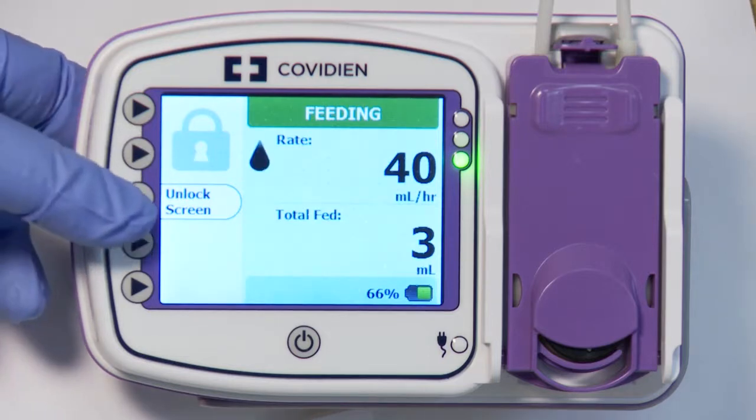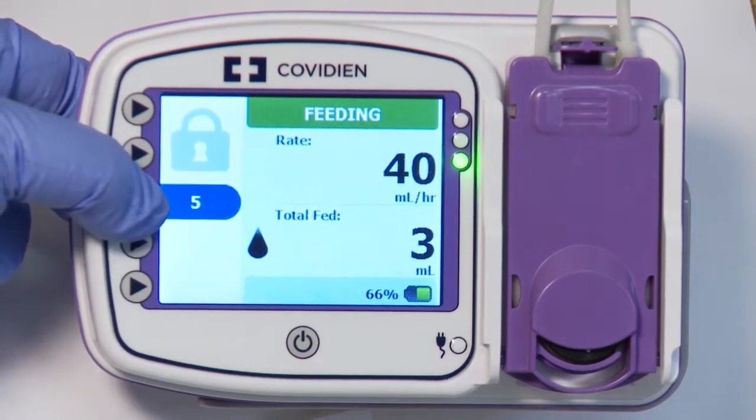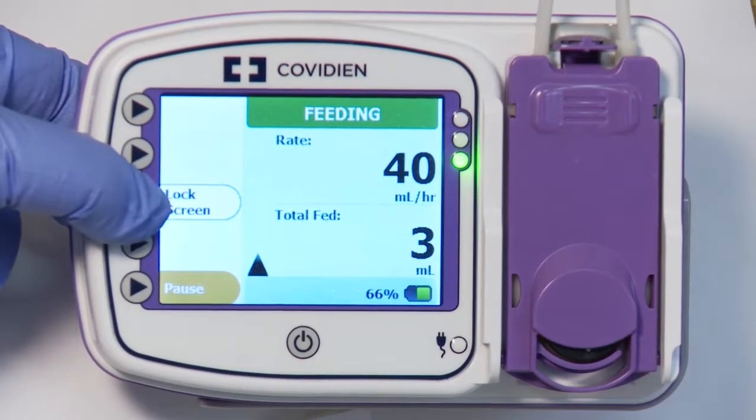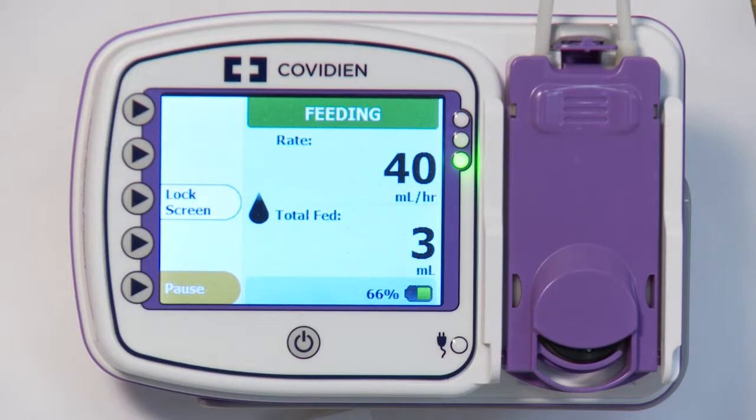Once activated, a lock symbol will appear on the feeding screen, showing that the buttons are disabled. To disable the lock screen so the buttons can be reactivated, press and hold the Unlock Screen button for 5 seconds. The buttons will now be re-enabled.